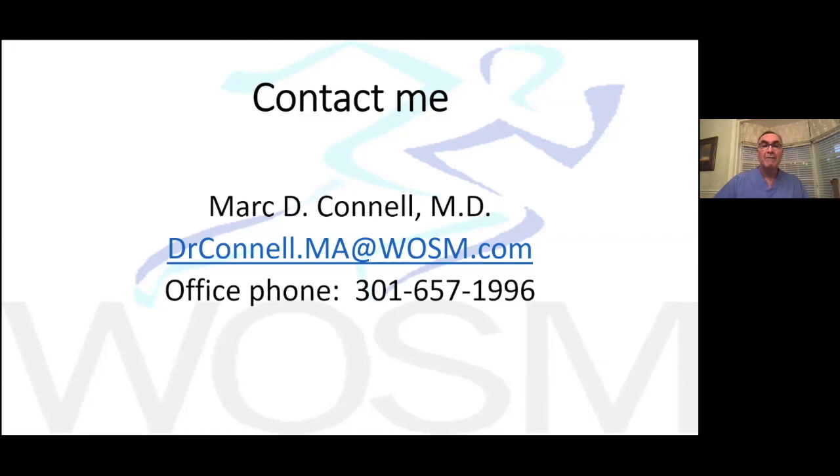So I have Peggy who asks, if you have a custom implant, can the surgeon still do this computer robot model and ROSA? If you have a custom implant, I'm presuming that you're talking about in a different joint, or if you already have one on order, is the most concrete way I can interpret your question. That is, if you were planning on a custom implant and it's already in process at this very moment, the answer is no. That is probably a conformis, and that instrumentation is dictated and constrained by the conformis technology, which is good.